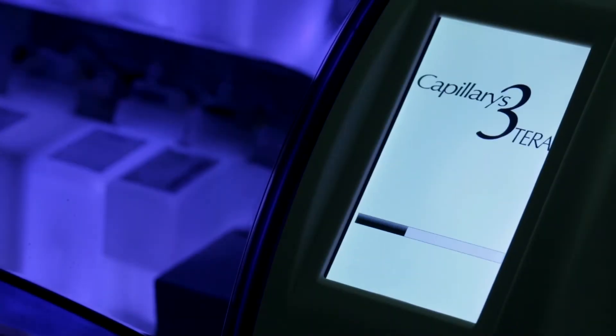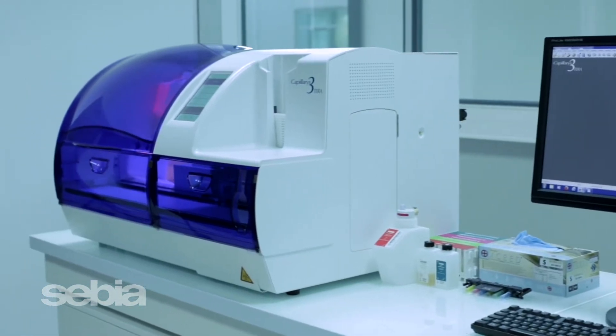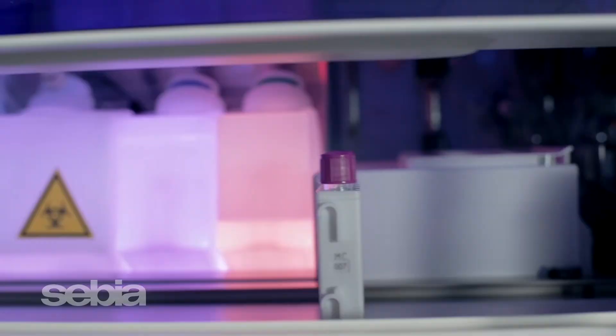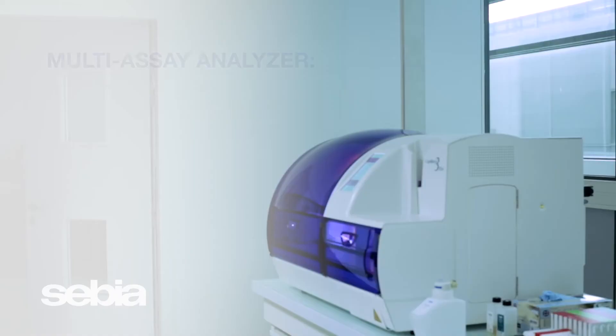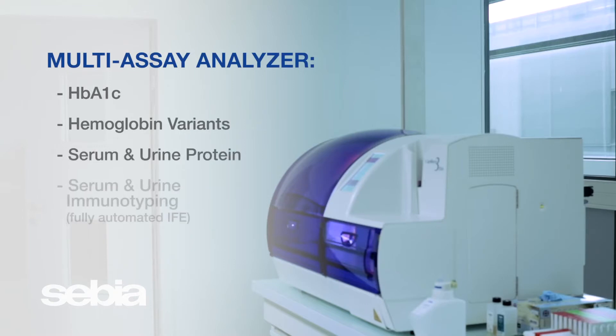Introducing the Capillaris 3, Sabia's newest generation of capillary electrophoresis systems designed to provide flexible workflow solutions to meet your current and future testing needs. The Capillaris 3 is a fully automated multi-assay analyzer offering enhanced throughput and increased walkaway time to provide improved productivity and efficiency in your lab.